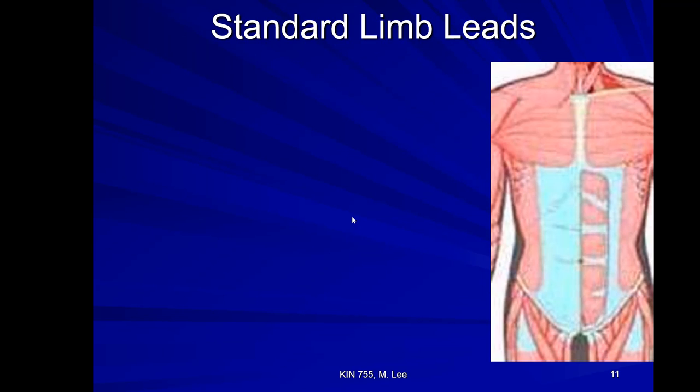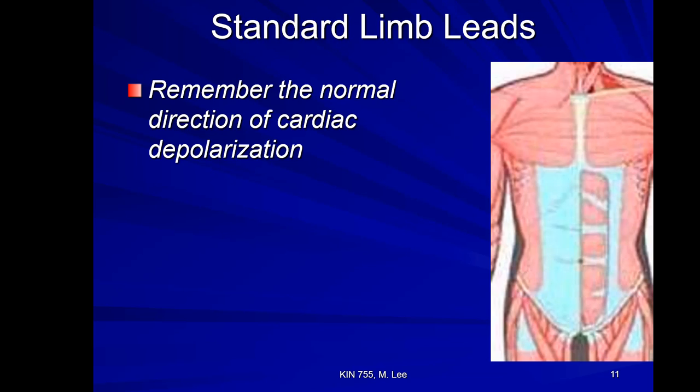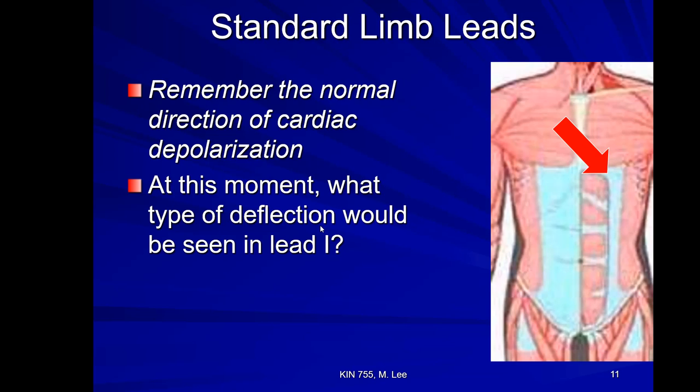All right, so now going through the different phases of the electrical activity in the heart and how that gives us waveforms. I want you to think about how electricity flows through the heart. In the healthy, normally placed heart, the major axis of depolarization is going to be in this direction. The heart's tilted to the left, and based on where the SA node is and how the electricity flows through the rest of the cardiac conduction system, it's going to go in that direction. However, we're going to break it up into 4 distinct phases.